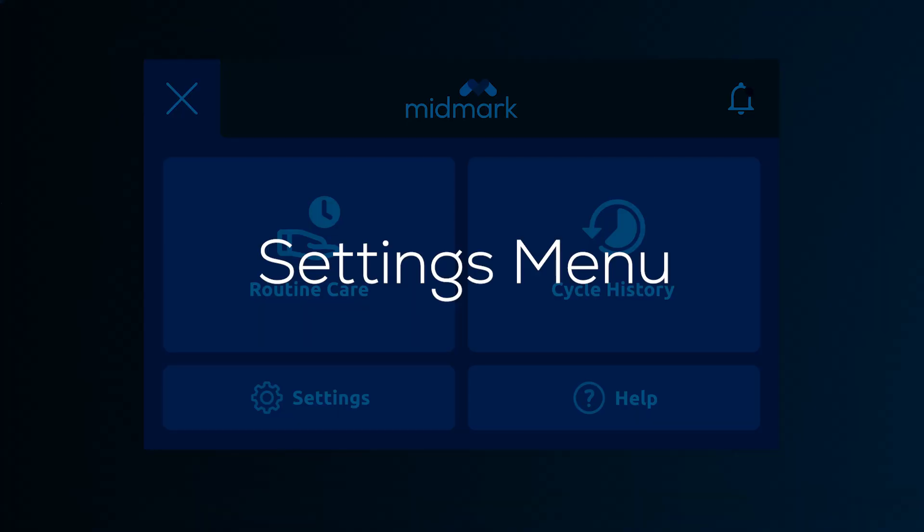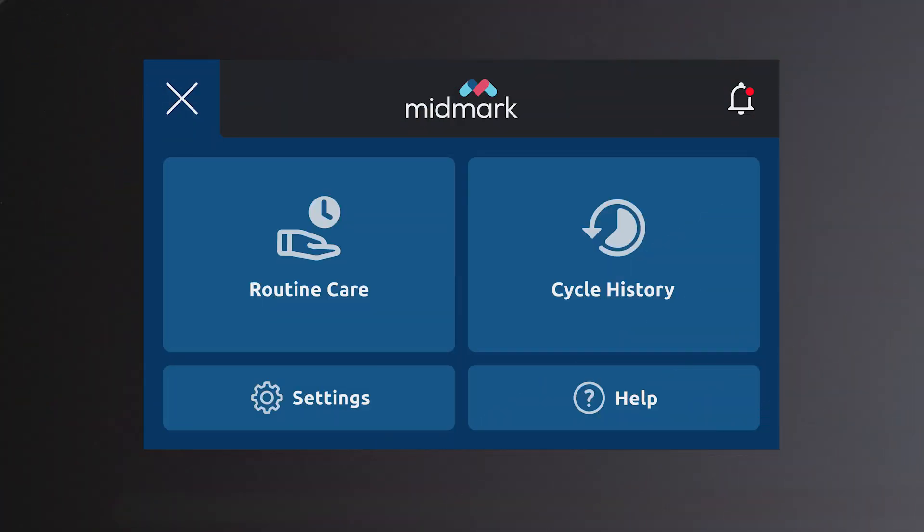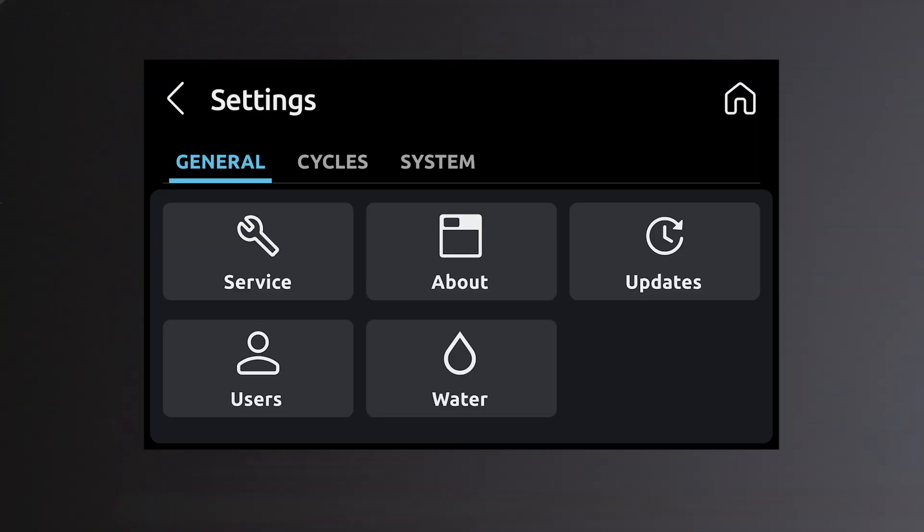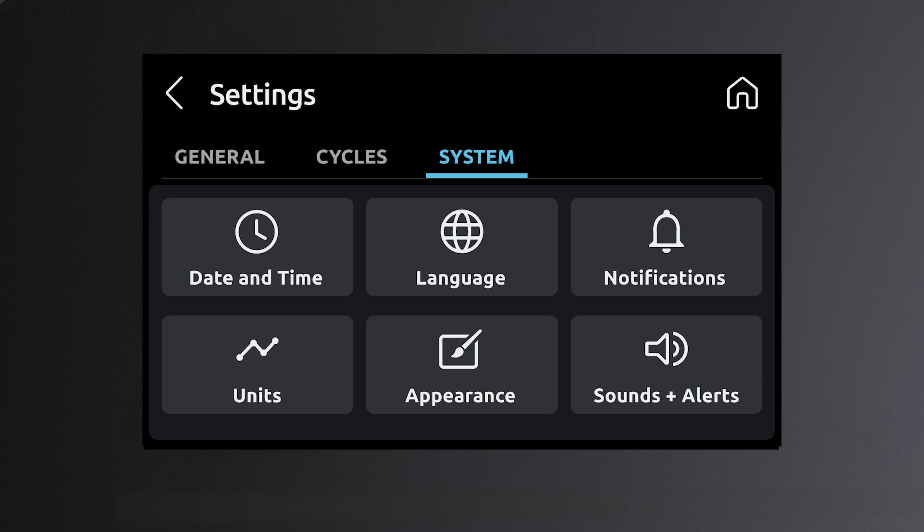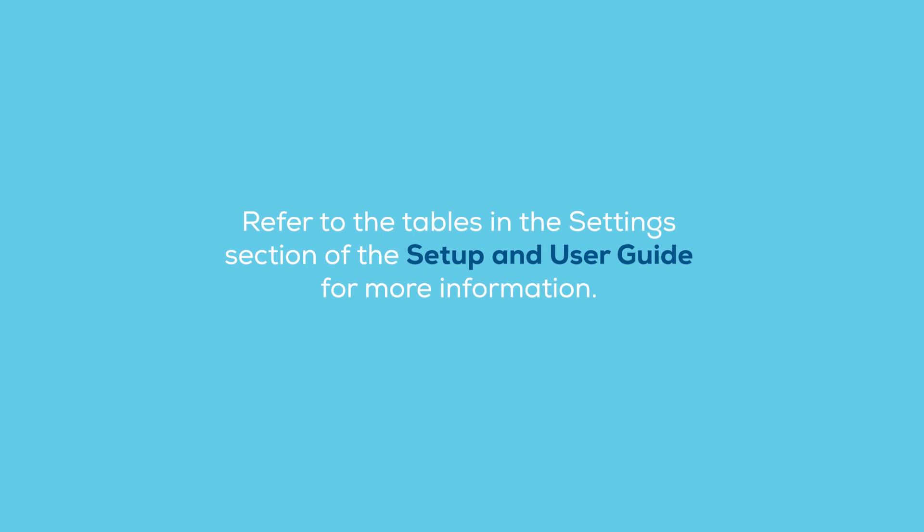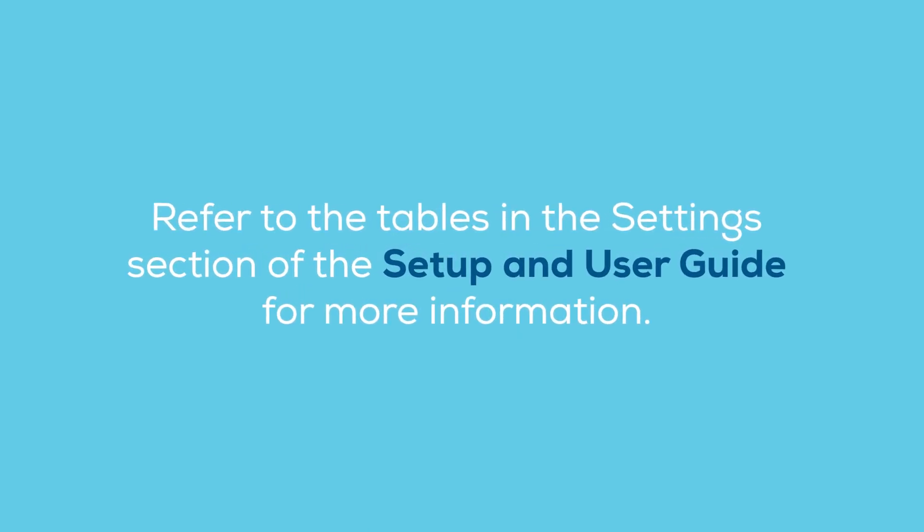Settings menu. Within the settings menu, there are three main tabs across the top of the screen: General, Cycles, and System. Navigating through these tabs will provide access to information and modifying device settings. Refer to the tables in the settings section of the setup and user guide for more information.